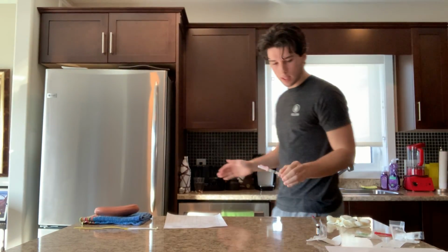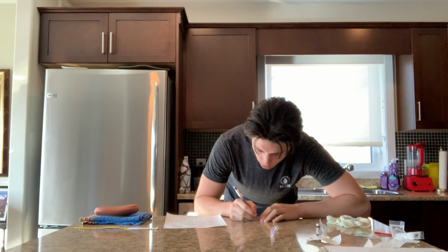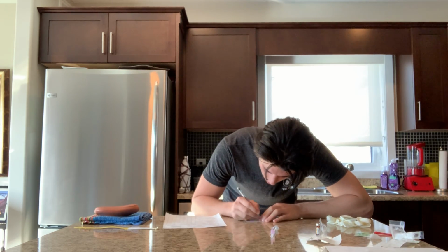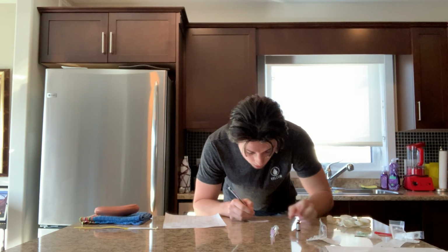And now I can set this down and right away create a medication label for it. So I'm going to start and write the initials, so JN for Jake Nursing, and the drug metoclopramide, and then the dose is going to be 5 milligrams for 1 ml, because the concentration we see is 10 milligrams for 2 mLs.